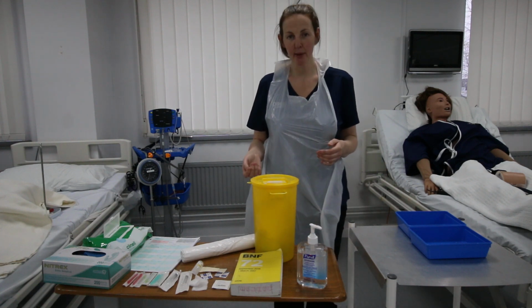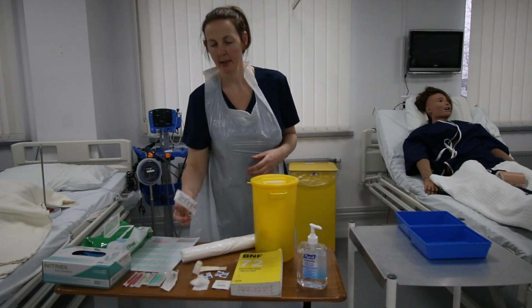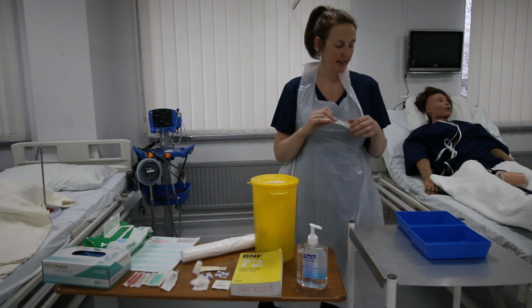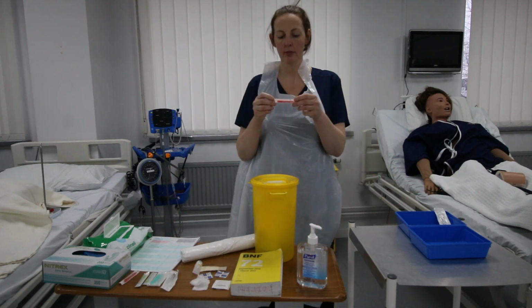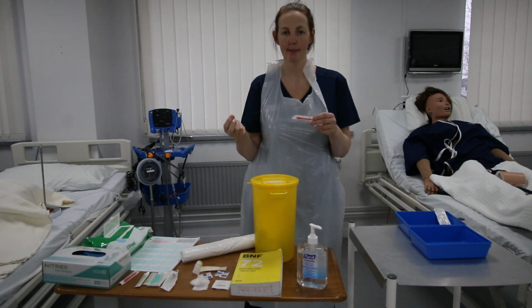I'm going to need the following equipment for my procedure. So, first of all, I'm going to need a 2 ml syringe. This is intact and this is in date. Put this in this tray here. I'm going to need a filter needle because I'm going to be pretending that the vial I'm drawing the hydroxycobalamin up from is glass.